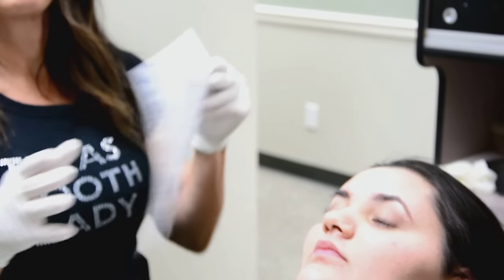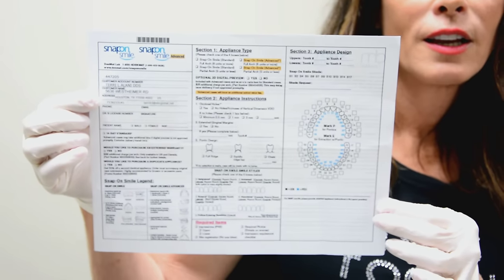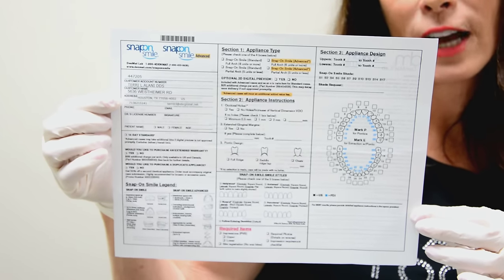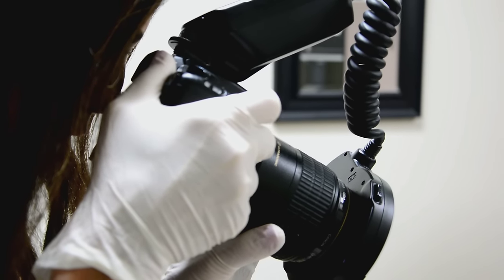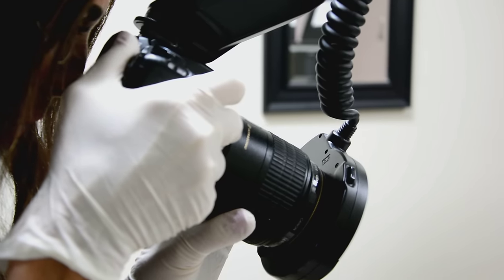Then we go ahead and fill out the snap-on smile lab sheet — this must be filled out completely. The next step is to make sure we get really great before-and-after pictures. We take our before pictures and send them to the lab so they will have a good guide for making the snap-on smile appliance.